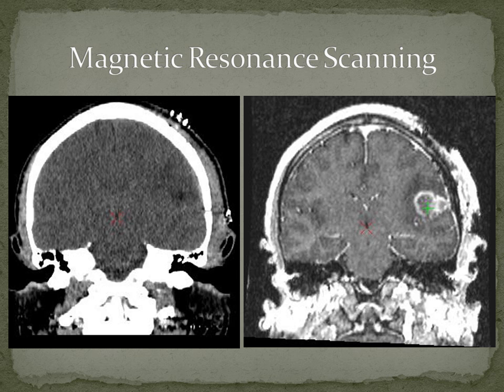Magnetic resonance imaging scanning. We've been relying on MRI for the better part of 2 decades now to give us our contrast resolution. It didn't take very long for us to actually get both MRs and CTs and realize that the target that we were actually treating every day was the MR target, and that the CT target was a subset of the MR target. We didn't see as much. We didn't have as good a contrast resolution.